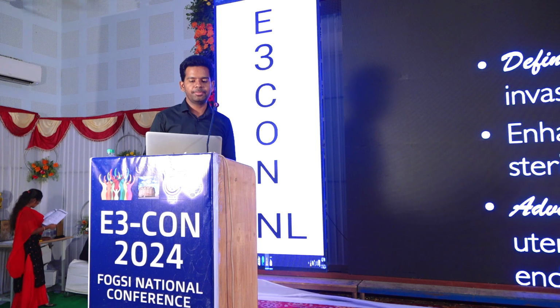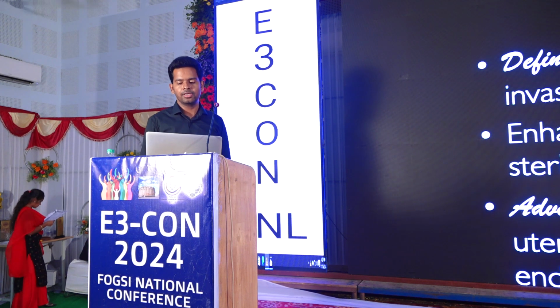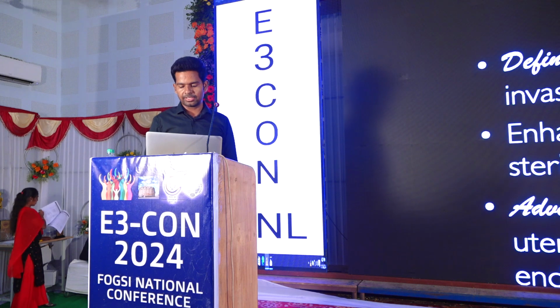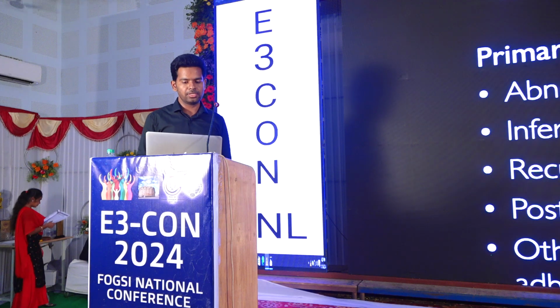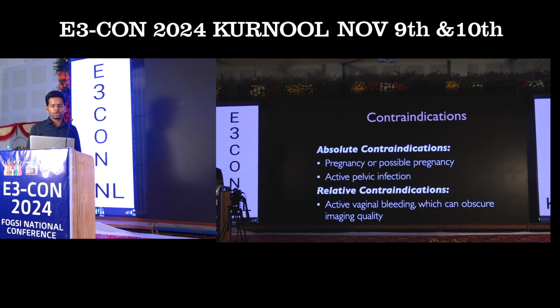Introduction: it is a minimally invasive ultrasound technique where we can see enhanced visualization of the uterine cavity against a dark background, which is saline. Advantages: it offers very clear imaging compared to routine TVS. We order sonohysterography whenever there is abnormal uterine bleeding with inconclusive TVS findings, infertility assessment, and recurrent pregnancy loss.